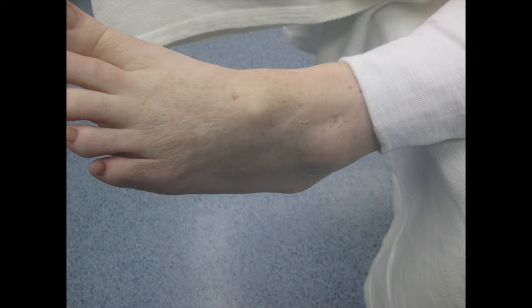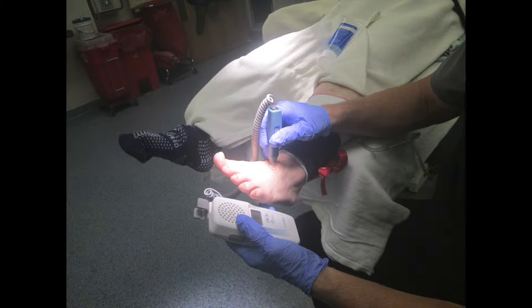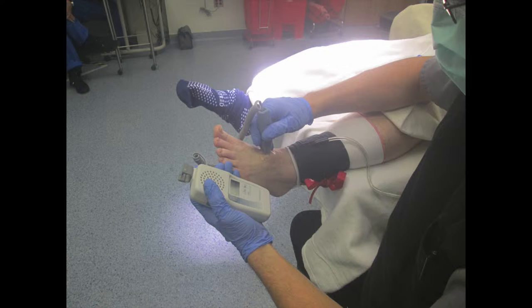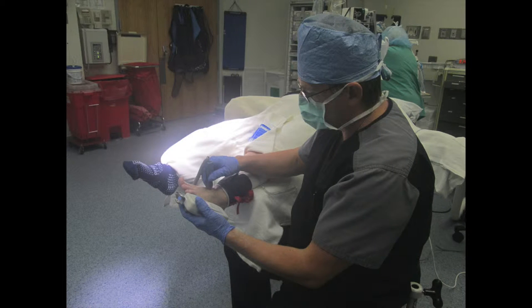Here's the patient on the OR table. You can see the dorsal exostosis on the top of her foot, which is painful in shoe gear and has also become very painful in normal activities. To ensure we didn't involve the neurovascular structures, we mapped out her arteries — marking out the dorsalis pedis pulse utilizing the Doppler. You can see me listening to the Doppler to get the exact location of the neurovascular structures to avoid. Once done, we took a marker and mapped out that area, allowing me to know exactly where to place my incision away from the neurovascular structures.